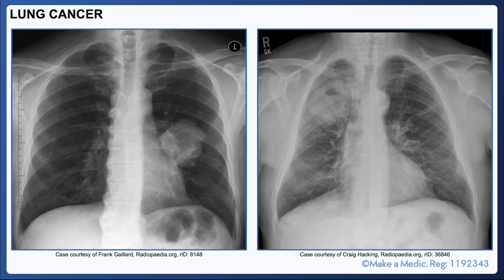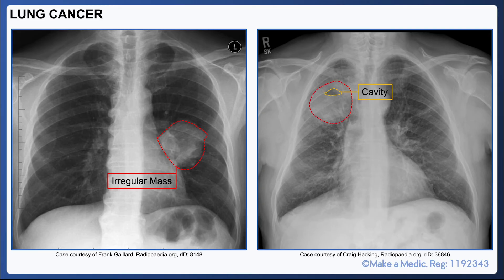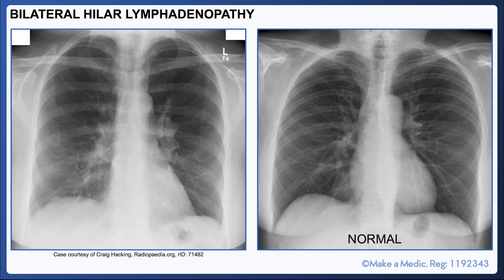Small lung masses may not be particularly easy to visualize on a chest X-ray, especially if obscured by other structures like the heart. However, abnormal masses are important to note as the patient is likely to require further investigations. In the example on the left, a large irregular mass is visible near the left hilum. On the right, you can see a large mass within the upper lobe of the right lung containing a small cavity — a feature most commonly associated with squamous cell lung cancer.